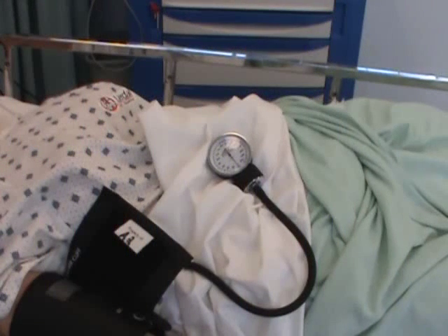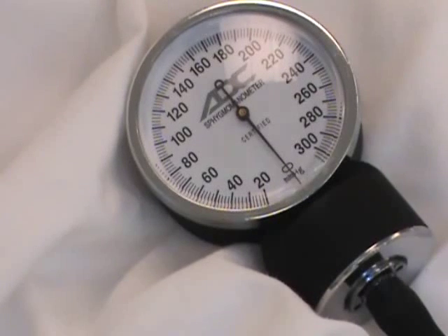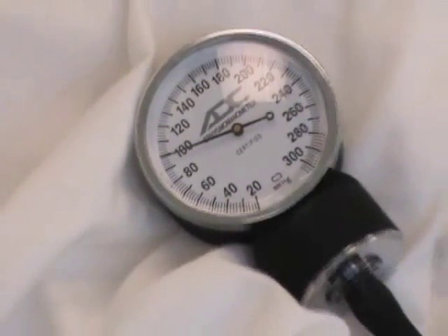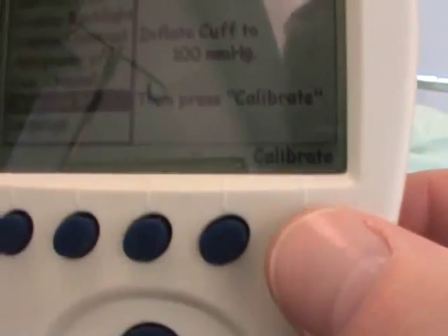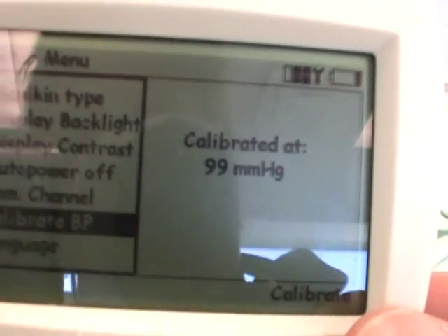The handheld device has told us to inflate the cuff to 100 and then press calibrate. I'm going to do something that nurses have done a million times and inflate the cuff, remembering that I'm only using the cuff that the machine came with. And there we are at 100. Coming back now to our handheld device, I press the calibrate button right here. And the machine says calibrated at 99 millimeters of mercury.